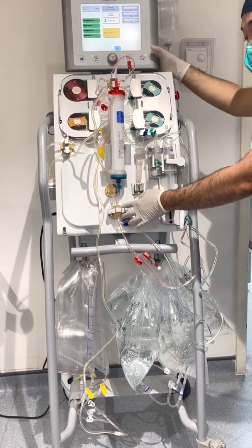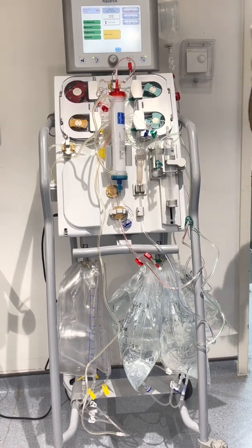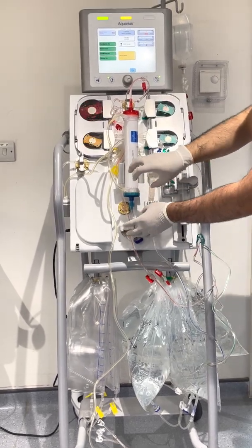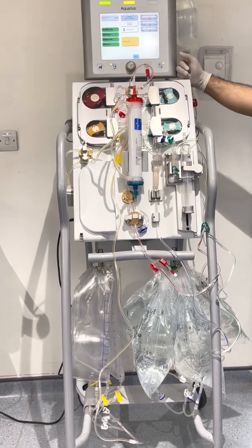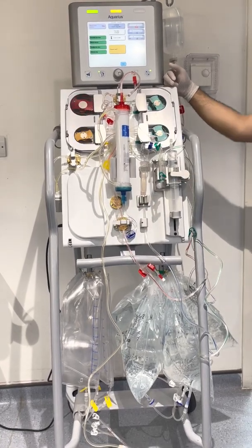This one exploded because on this, there's a soft part from the back of this port. It's a thin rubber, so it's very sensitive. So of course, if the venous pressure is high, the pressure will be applied on the weakest part of this. So this is the weakest part. It exploded really. The blood spilled out.